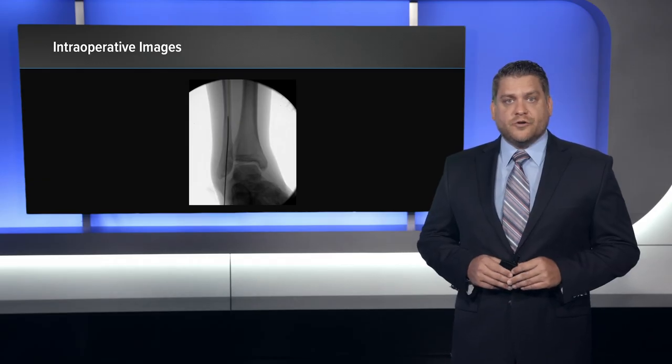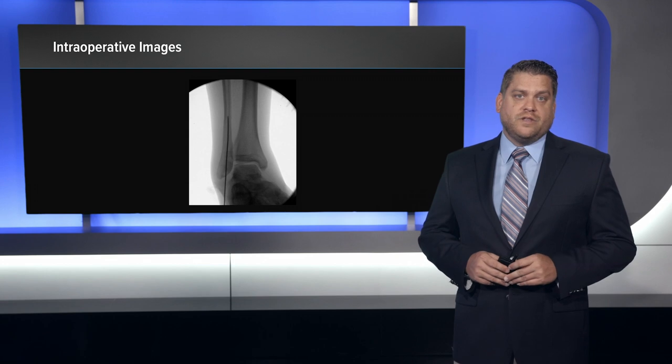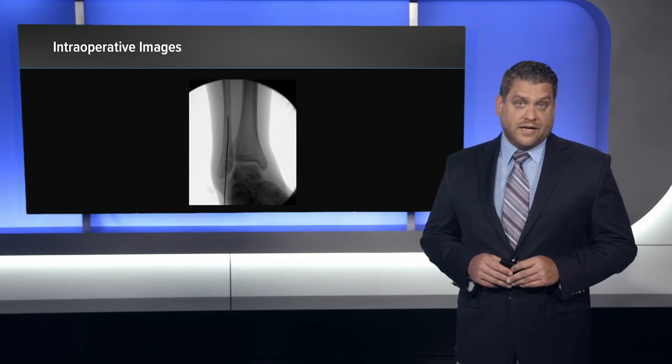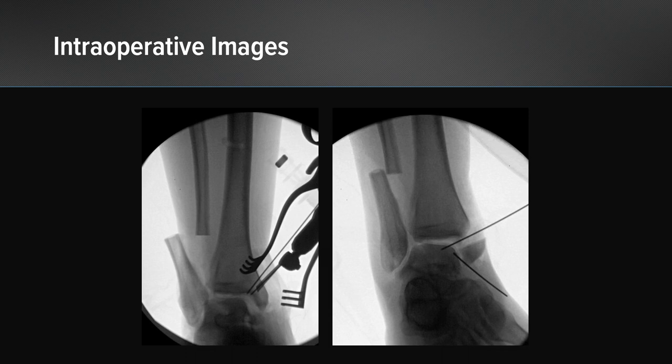Here we have the first portion of the procedure, which is planning for the fibuloc nail later in the case. We use the guide wire to establish the trajectory for the fibuloc nail, pre-drill for it, and ensure that the nail sits in an appropriate position before proceeding with opening the lateral and medial aspects of the ankle.